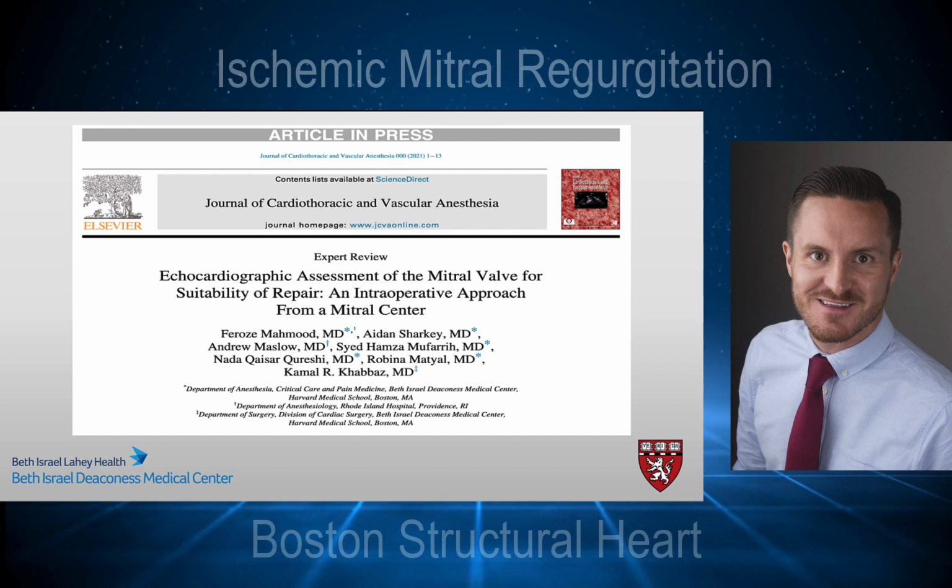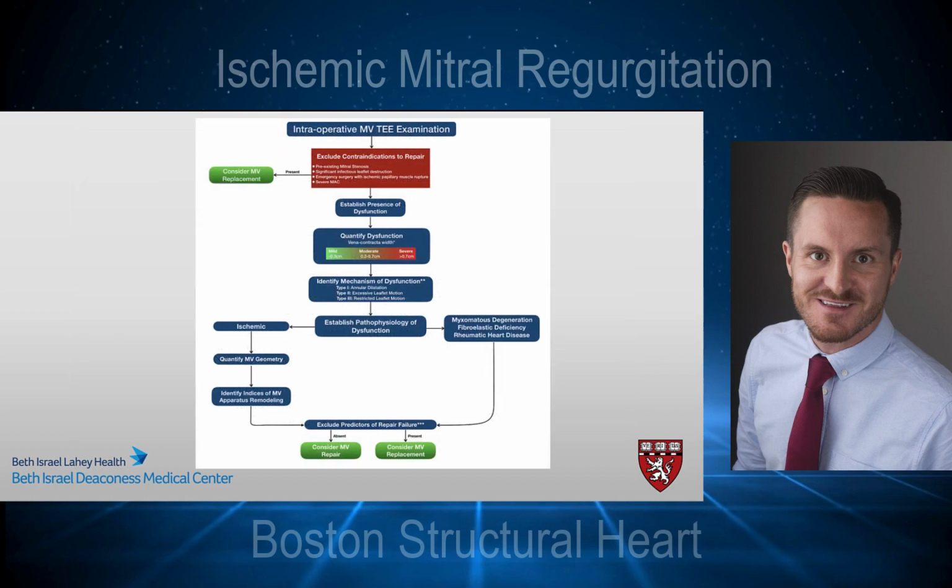We have recently published our approach, and this approach is not meant to replace well-established guidelines that already exist on how to examine the mitral valve, but merely to highlight how we approach a mitral valve for suitability of repair. This is our algorithm that we utilize, and I'll be referencing this algorithm throughout the remainder of our talk when we begin to discuss some cases related to ischemic mitral regurgitation.